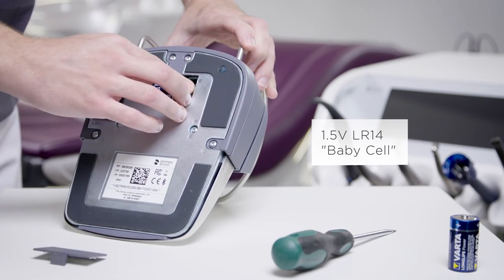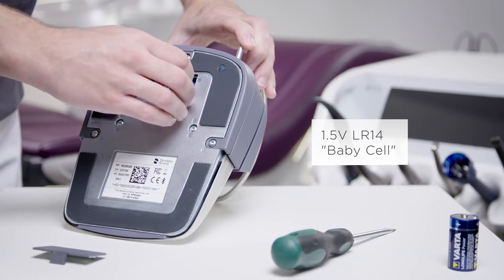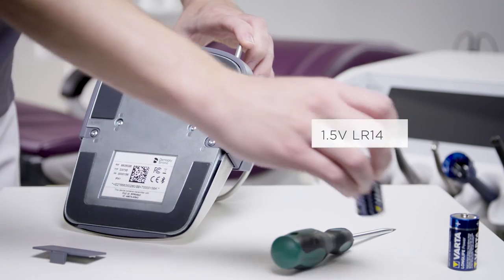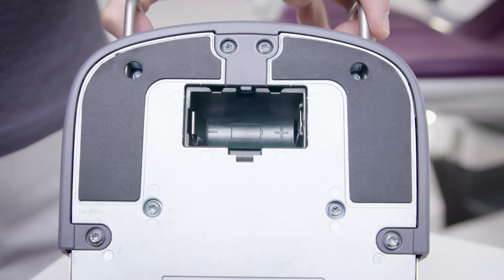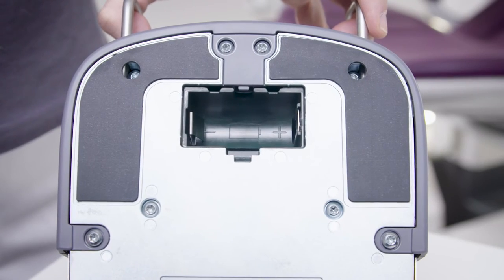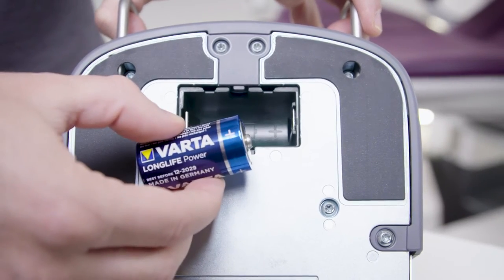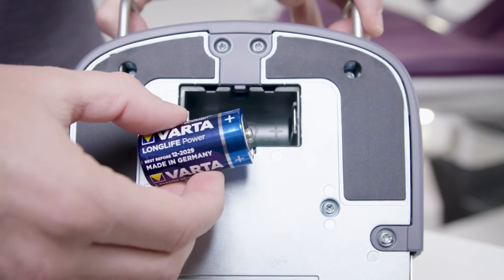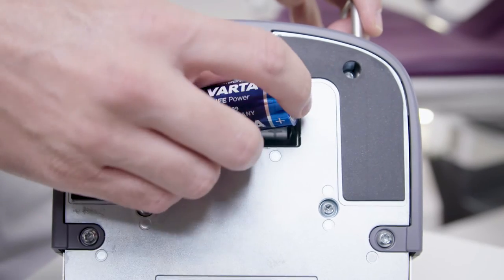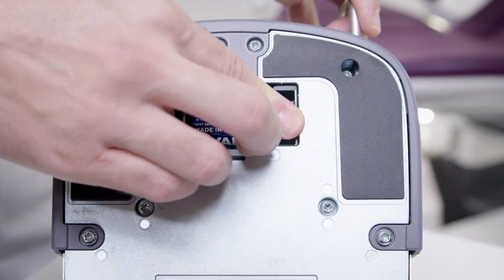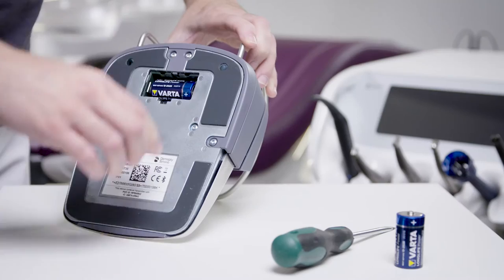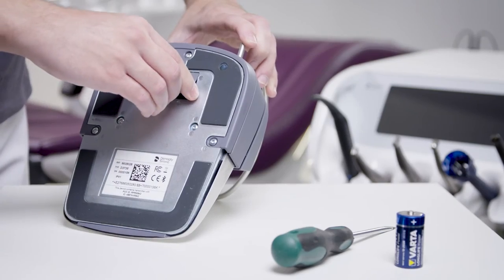Replace the battery, ensuring correct polarity. Now close the battery compartment.